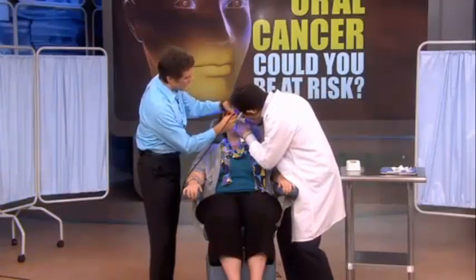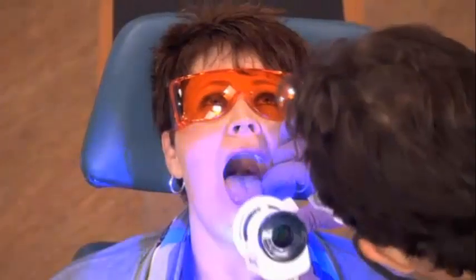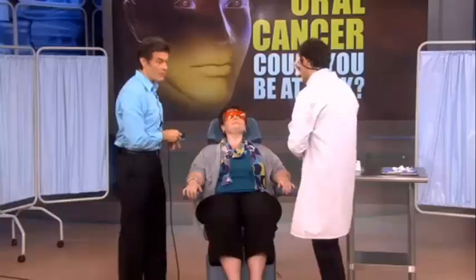And we're going to look through. It's a narrow blue light. I'm just going to put this on there so everyone can see as well. A narrow blue light with special filters. And you see the green, the kind of apple green color. That means health. But when the cells start changing a little bit, let me show you an example of what happens when they do change.